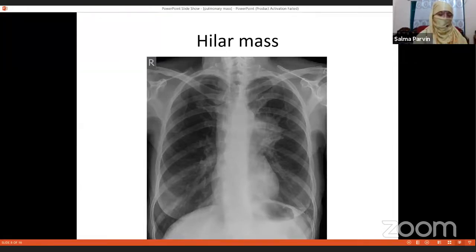Probably we are going to the last slide of the lesions today. This is an old patient, a female, and you see there is an irregular mass. What is the difference between regular and irregular? When you go through an x-ray, you get a very nice evaluation of the margins. You see that this is spiculated. Minor spiculations are rooted around the margins. So this is an irregular lesion.